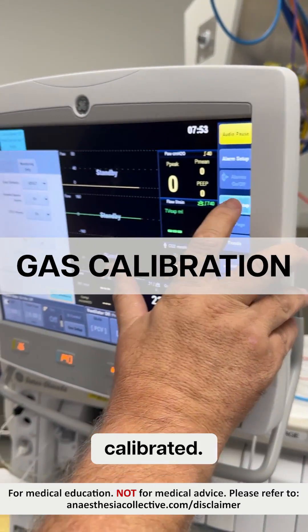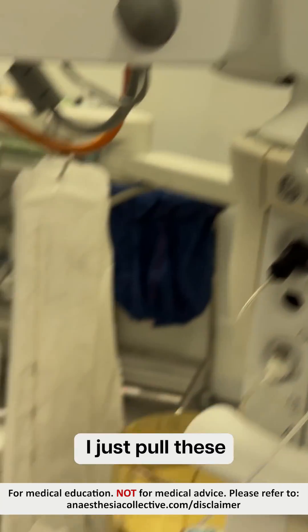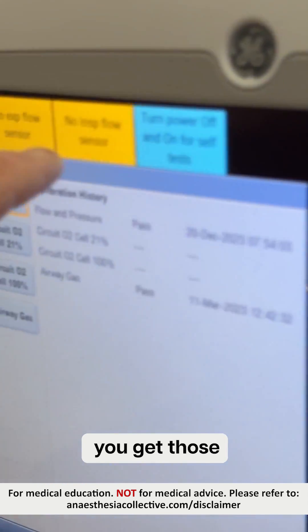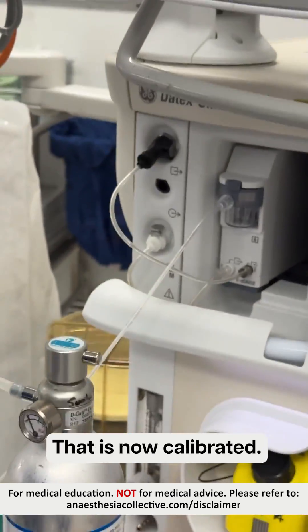First of all, we're going to check that the flow sensors have been calibrated. So I go to System Setup, Calibration. To calibrate those, I just pull this out at the side there. You'll see that you get those two yellow signs up the top there. So I push them back in. That's now calibrated.